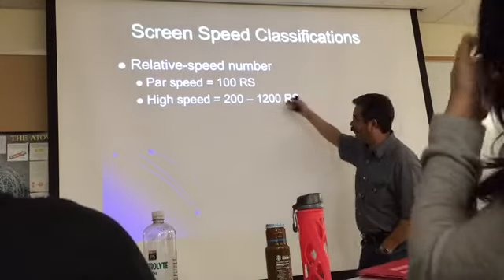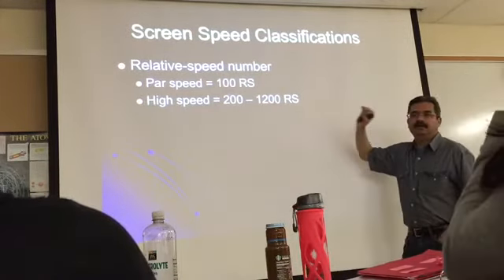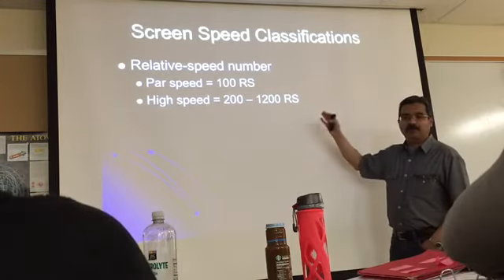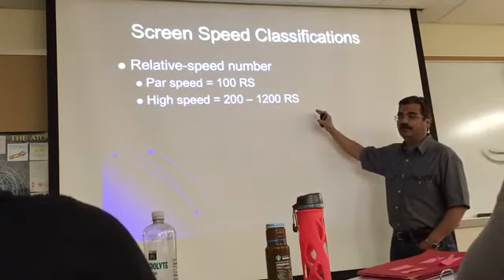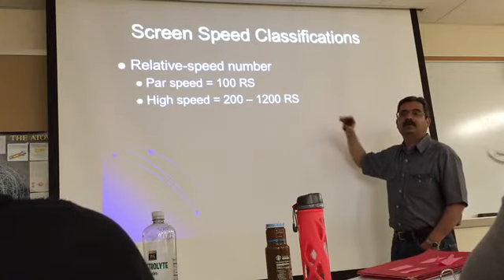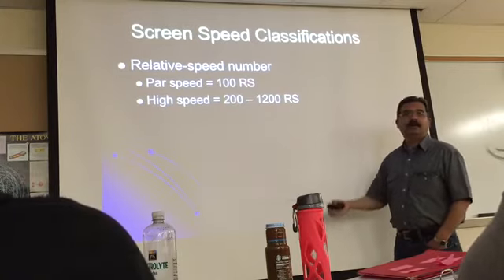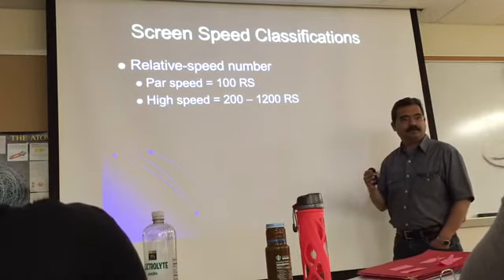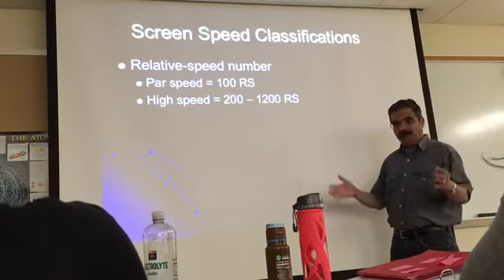Were there other speeds used? Yeah, and it depended on the hospital, but most commonly 200 and 400. Now, I also remember working with 800 speed screens, and they were used for angio. Now, I'm talking angiograms before the digital era, where we had to do films.